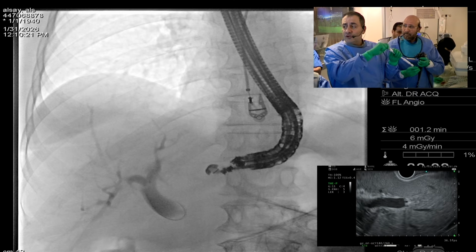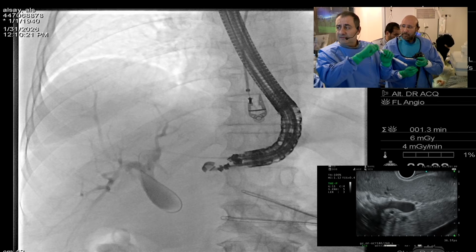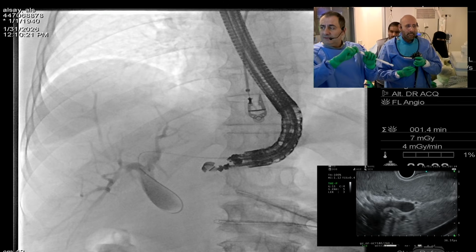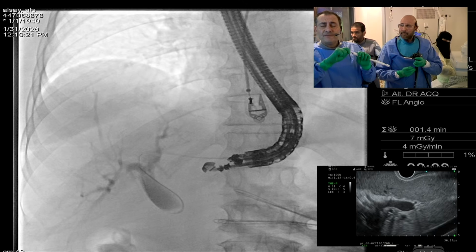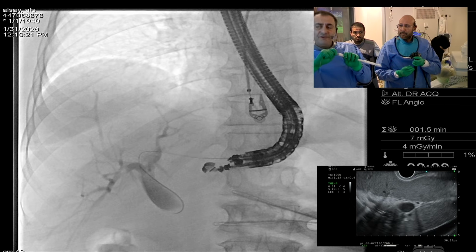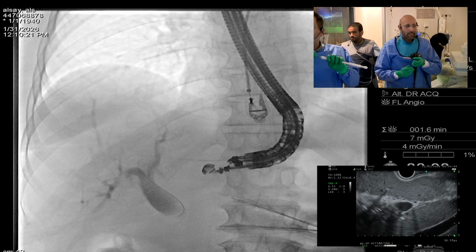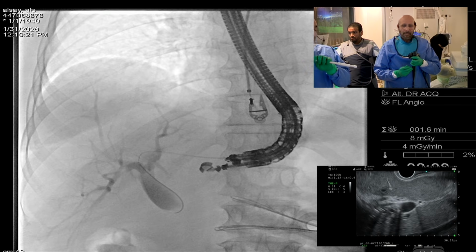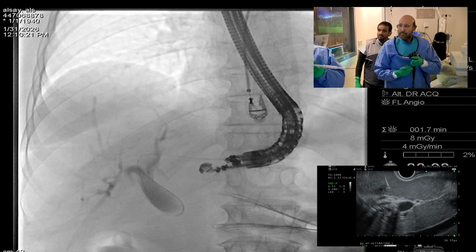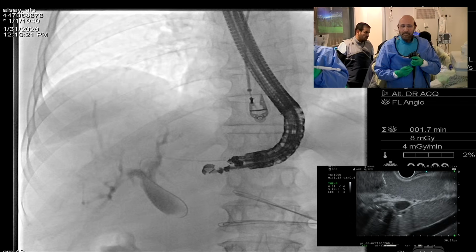Okay, you have to go slowly, Asharqi, because this is, as you can see here, okay, we don't want to lose the access now. So as I said, at least a 2 millimeter biliary tree branch is sufficient. But once you're in with a needle, you can then inflate it. Here, it was a little bit more complicated because the perc drain did a very good job. So now Dr. Asharqi is going to focus his attention onto the wire.